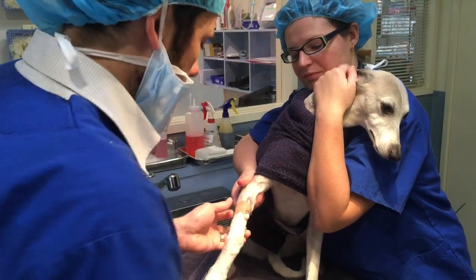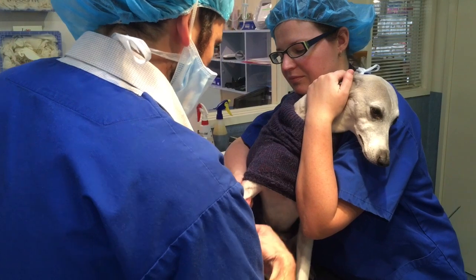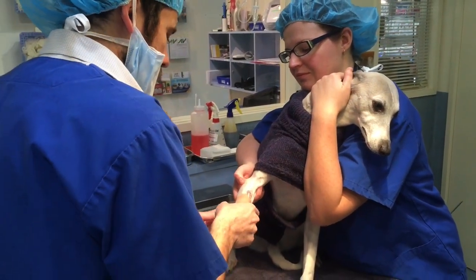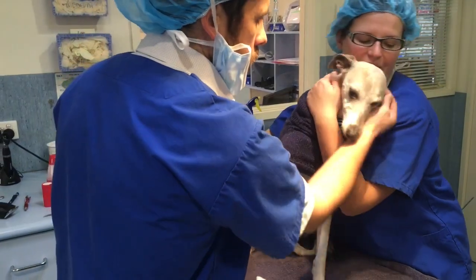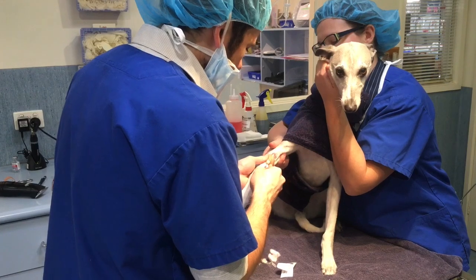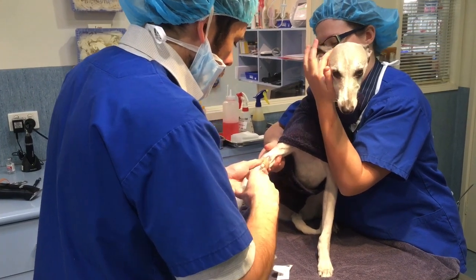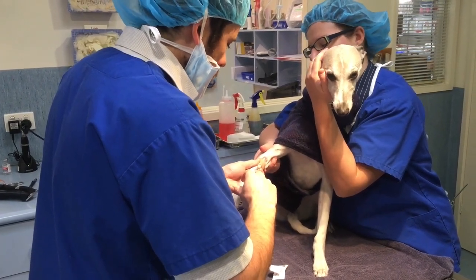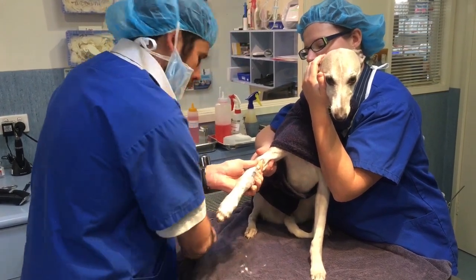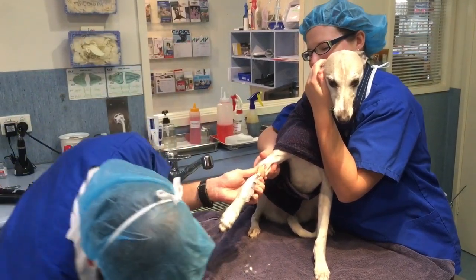That way we can give her the induction agent. So now we're ready to rock. This is the induction agent that we use — it's called Alfaxan. Just give a little bit to effect at the start. Clean up the mess so the nurses don't yell at me.